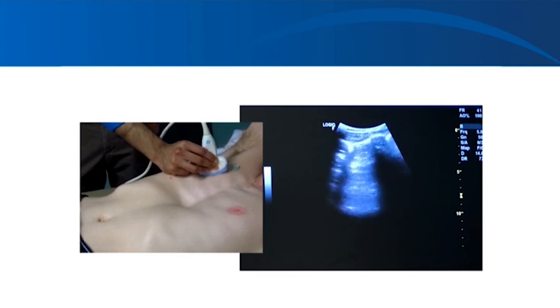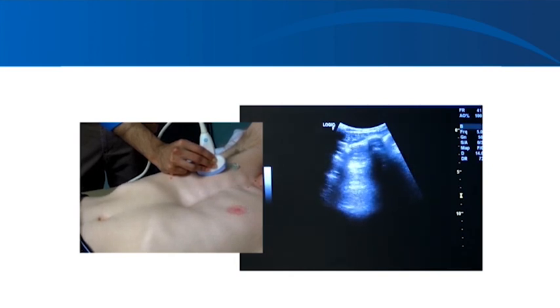This usually requires slowly tilting the transducer until the desired view is acquired. Be mindful of the curvature of the chest wall, adjusting the transducer angle as the exam proceeds laterally to maintain a perpendicular orientation to the pleural surface, because you get best images in grayscale ultrasound when the beam is perpendicular to the organ of interest. The cortex of each rib reflects ultrasound waves and blocks their transmission, resulting in shadows emerging from the ribs. The parietal and visceral pleurae appear as a single hyperechoic pleural line.